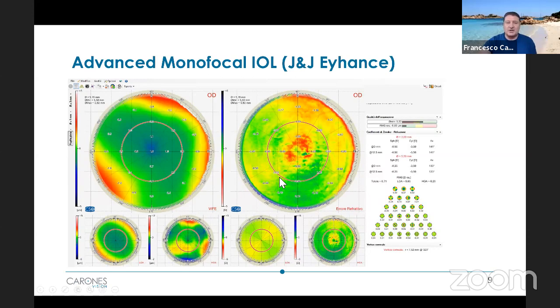You see here that compared to what we saw earlier, we see a little central red bump, meaning the lens delivers light in the myopic range. And this is what the lens is supposed to be, like a lens delivering most of the light for distance, but with a little bit of a central part that delivers for intermediate.